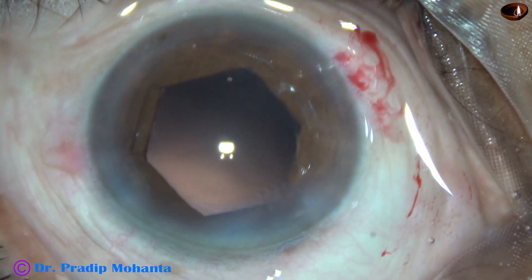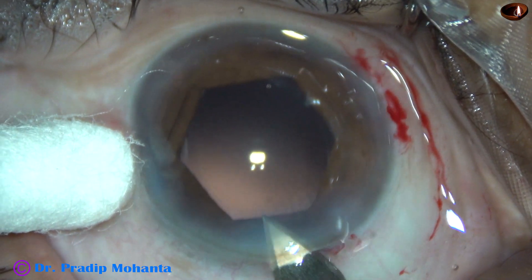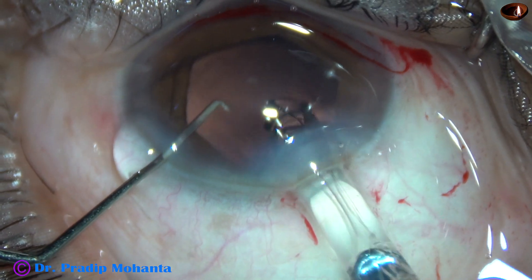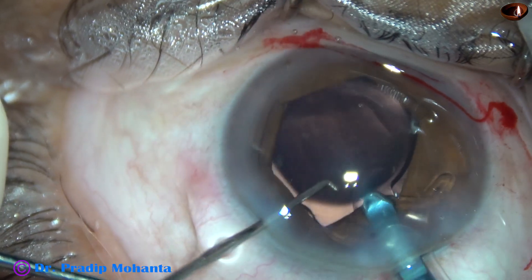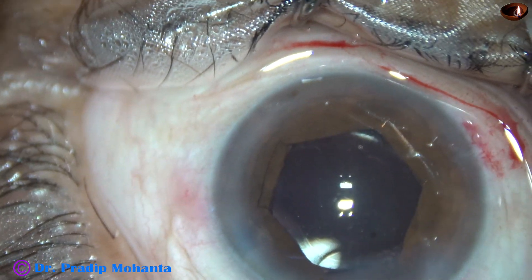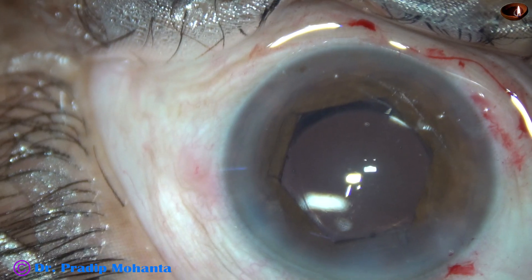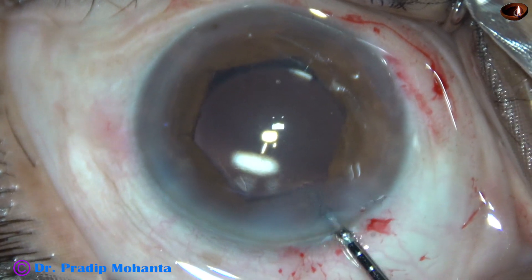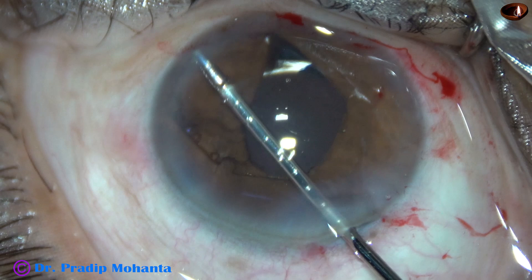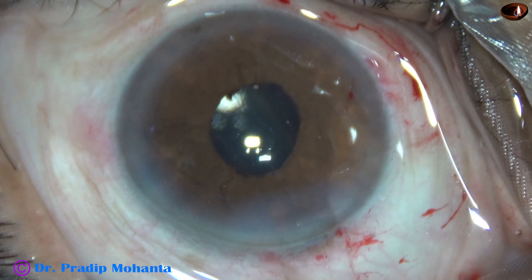Now is the time to implant an intraocular lens. Since this is an enlargement of the main wound, and we have used the B-hex pupil expander, the lens should be delivered in the bag and not over the iris. If we deliver it over the iris, the B-hex may get dislodged. The lens is dialed into position, and now the B-hex pupil expander is removed.